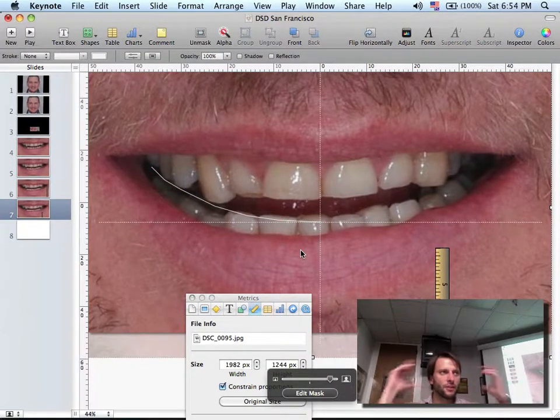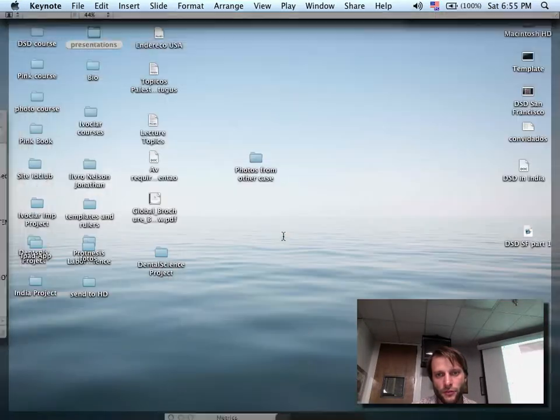We have to have all this information in mind. At rest, smiling, video, profile, picture at 12 o'clock, gender, character, age, lip dynamics. Mix everything and come up with one first guess. So let's draw.